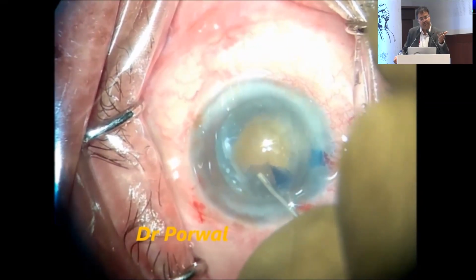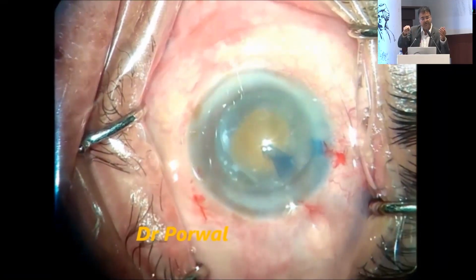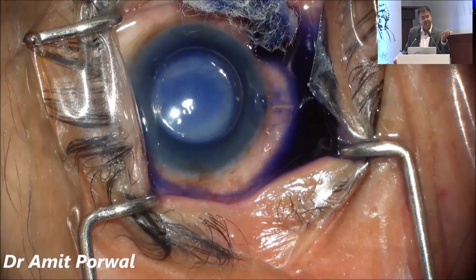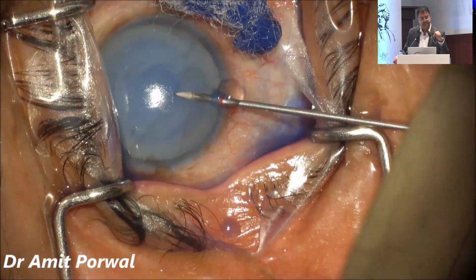Sometimes when there is no support, you can just move the nucleus towards the part where you're going to do the rhexis. So the nucleus will act as a support over there. So these are the small tricks that you're going to use. See, the rhexis marker is very, very important.